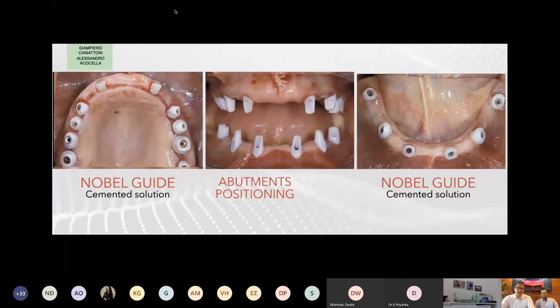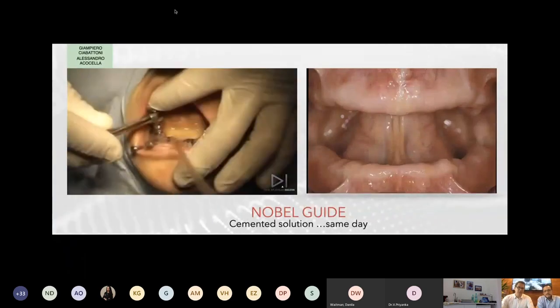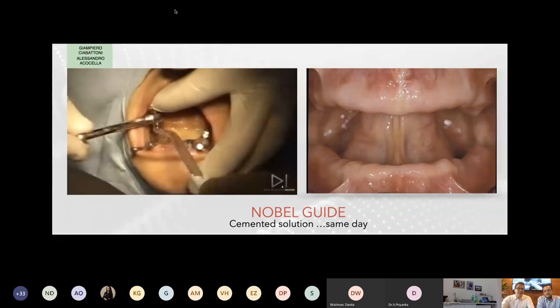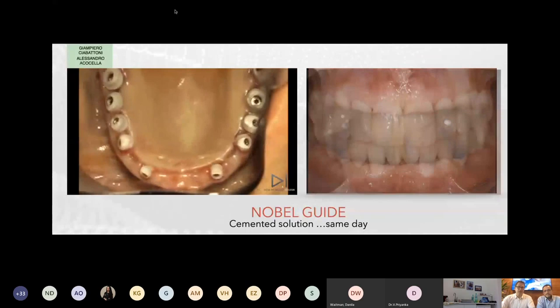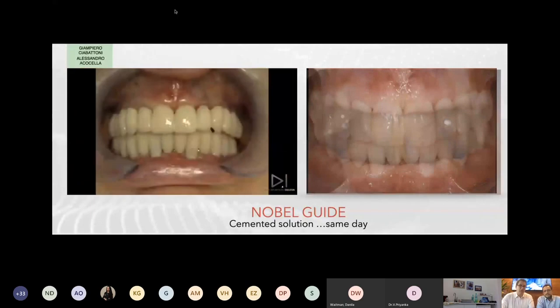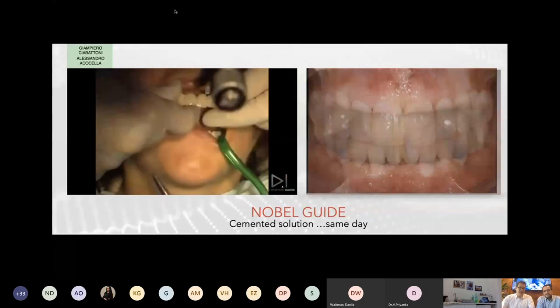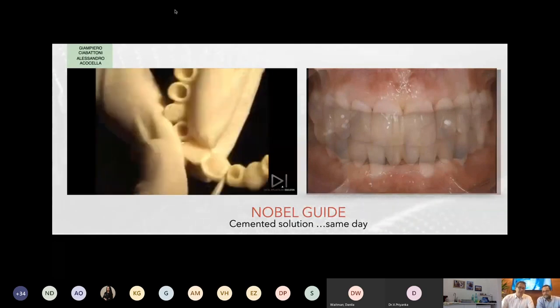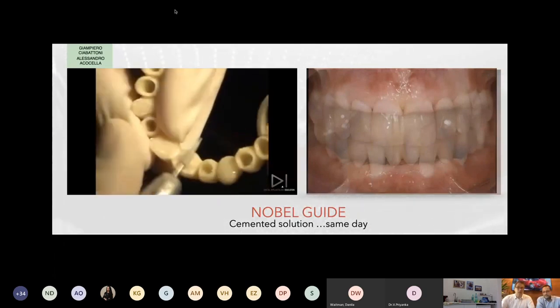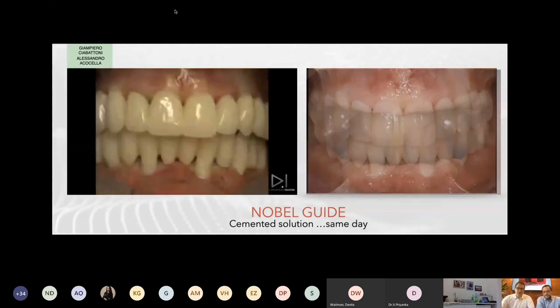And finally, you can see this short video. It's a very old video with very low quality, but you can see it's very important to have stability of the implant in the final position. We manage the abutment, we try the provisional bridge, and now Mauro Fradiani starts to manage the tissue. We want to control the healing of the tissue. You can support the tissue and completely design the emergence profile of the new situation of the patient.